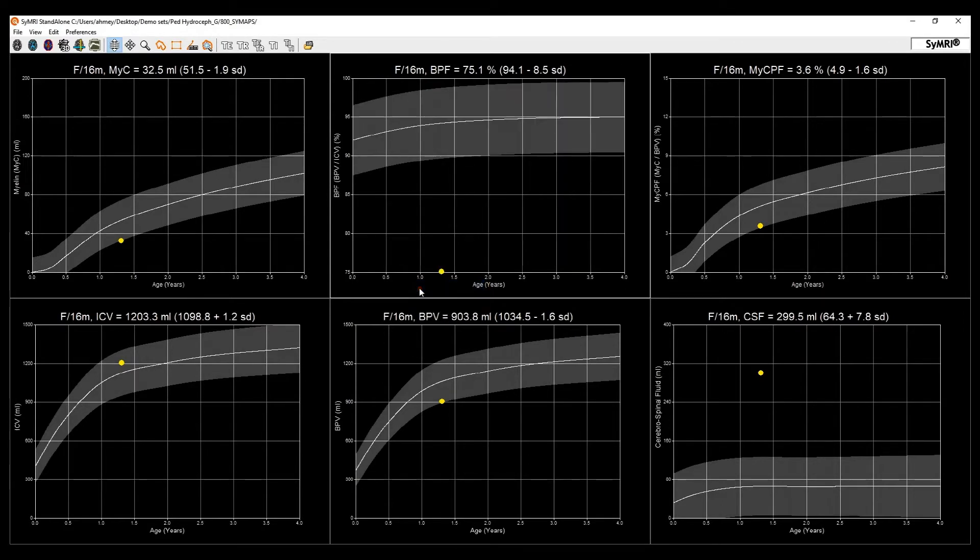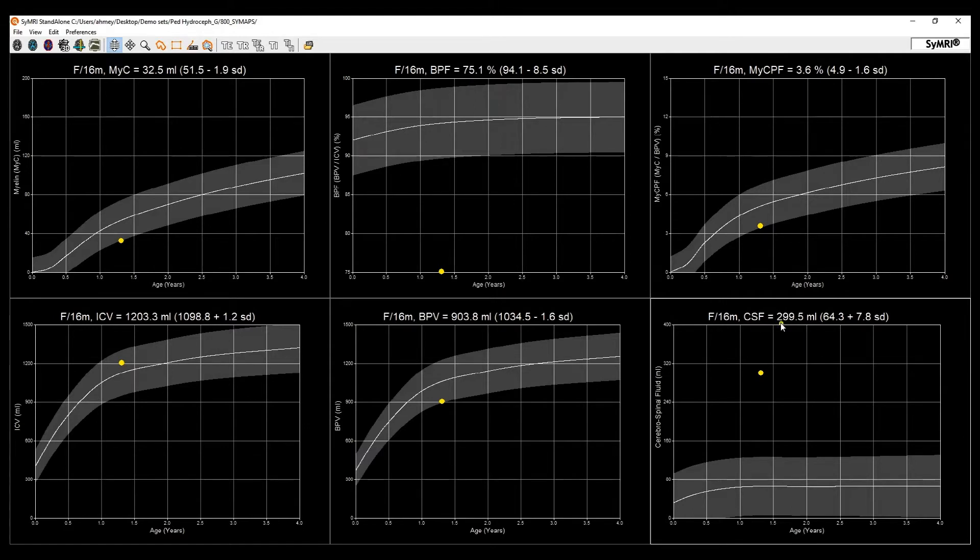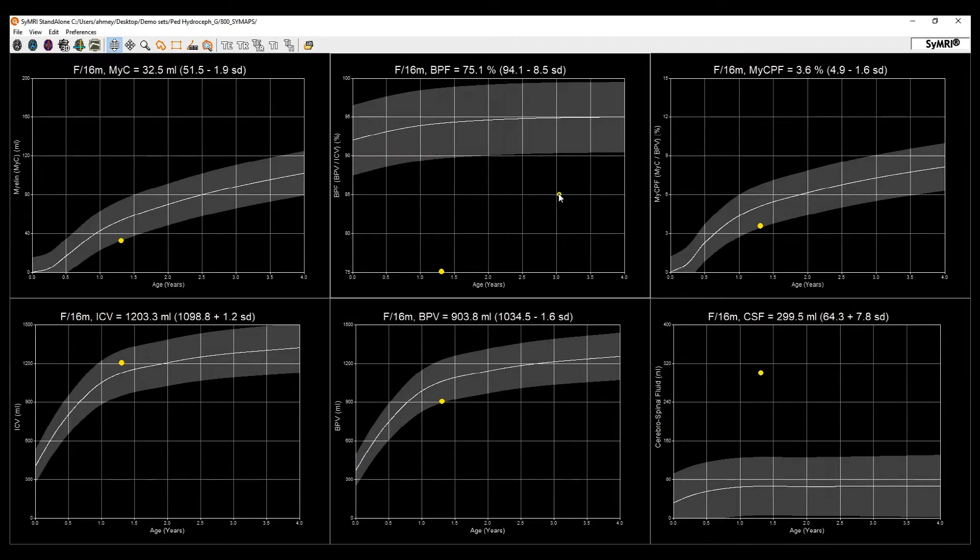This particular case belongs to a 16-month-old female with severe hydrocephalus, which can be quantitated by noting the CSF volume that is 7.8 standard deviations above normal and the brain parenchymal fraction or BPF being 8.5 standard deviations below normal.